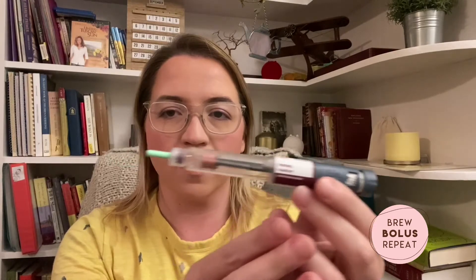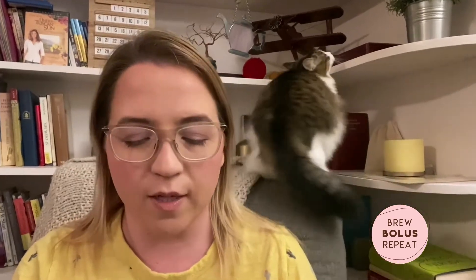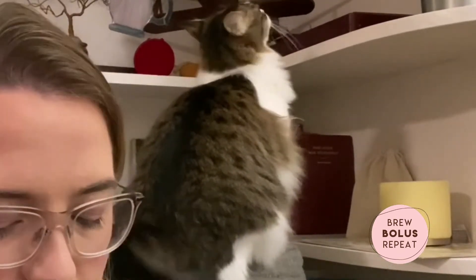My short-acting insulin is Humalog and that's in pen form as well. I've got the same pen tip on there right now, and I do change those out — I just had them all ready to go. So that's my current regimen.